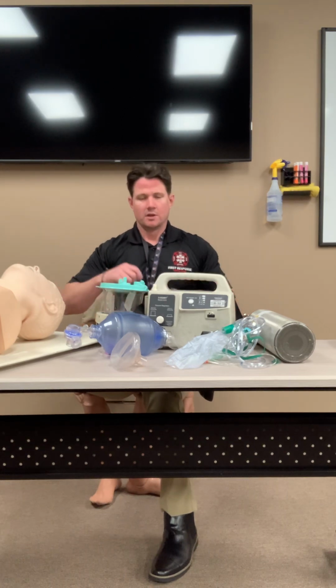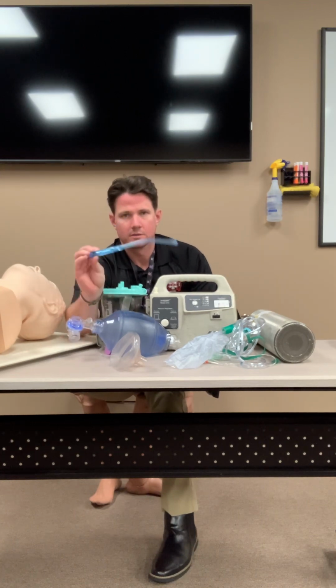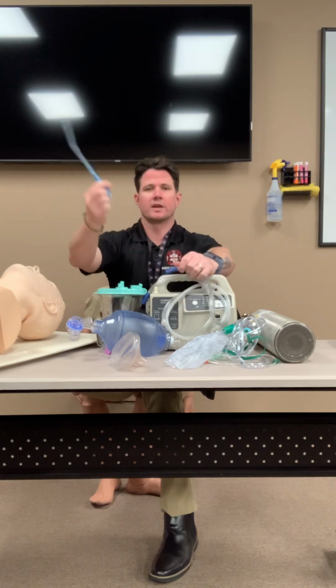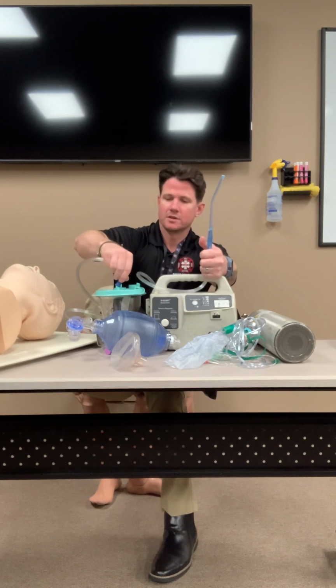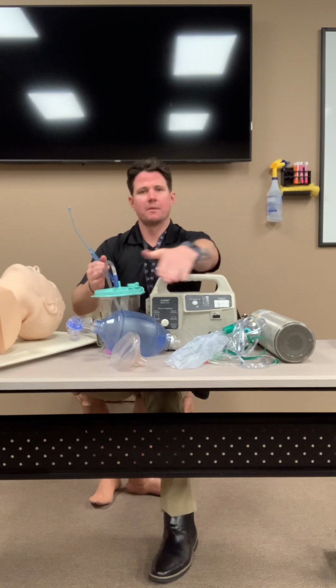So you will have a hard Yankauer suction catheter, rigid tip, right? This is your suction tubing. Both ends of the tubing are the exact same. One end of the tubing goes into one side. The other end plugs into your suction canister. All right, so now I'm set up, my unit is on.